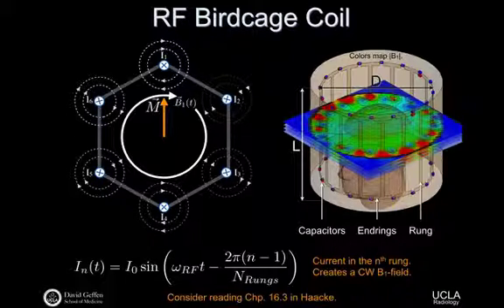But there is some connection, we'll look at this a little bit today, between the current that you need to drive it with, the duration of that current, and where your spins will end up. Right? So if it's a low amplitude, if it's no current, nothing happens. If it's more current, I can push things faster, right? And then the duration that the current is on determines how far things will get towards the transverse plane.